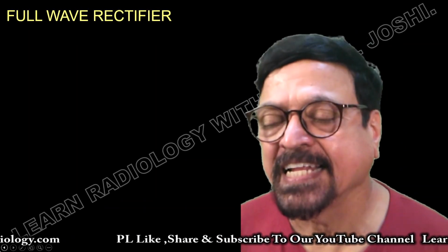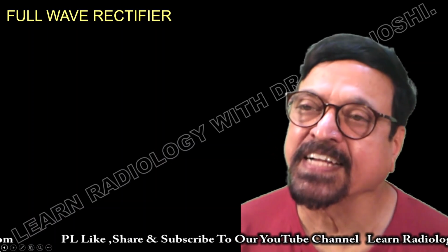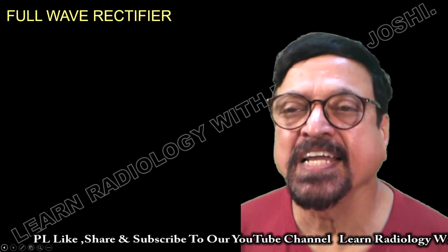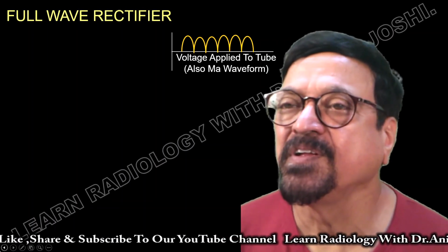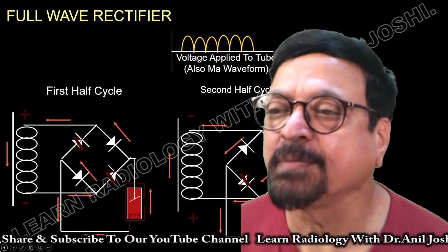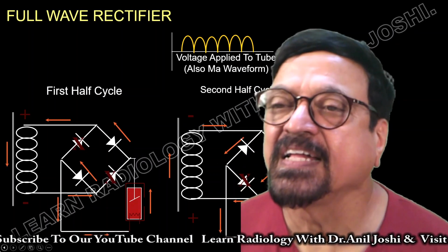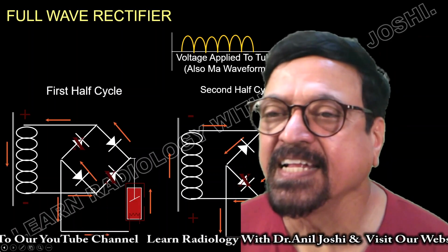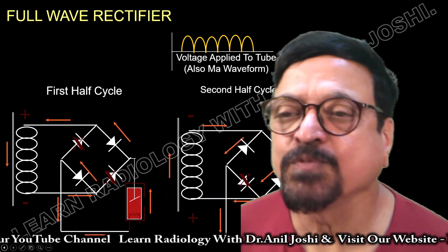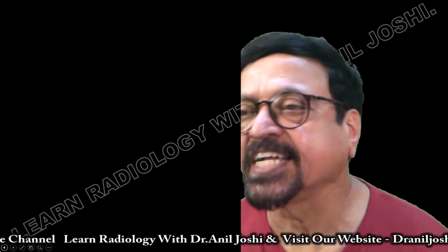power properly, that is the AC power coming from the generator is effectively used, and it is totally converted into X-ray without wasting. And here is how the waveform of full wave rectification looks, and this is how they are connected. Now first half cycle and second half cycle, see how they are connected. By just connecting these 4 diodes in a different way, we achieved full wave rectification.